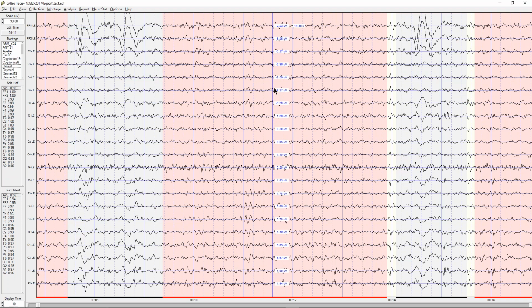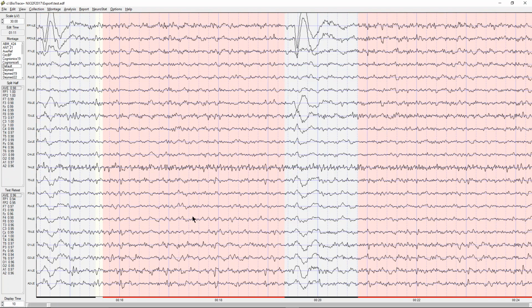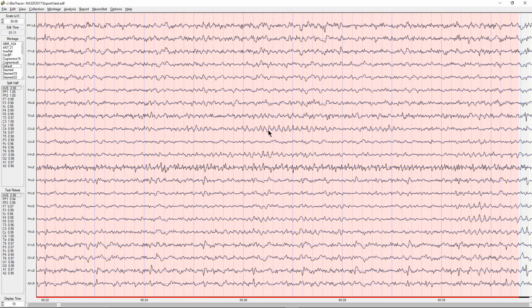As I click on this, it shows me the voltage at that moment of the EEG. And none of these, well, this one exceeds 5 microvolts, but they really should exceed at least 10 microvolts, and more appropriately, if it was an eyes closed recording, it should exceed 20 microvolts. But even in an eyes open recording, we should be getting 10 microvolts of EEG, at least somewhere.